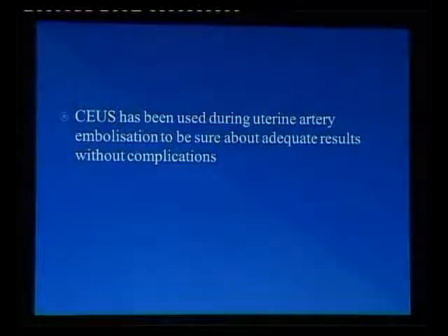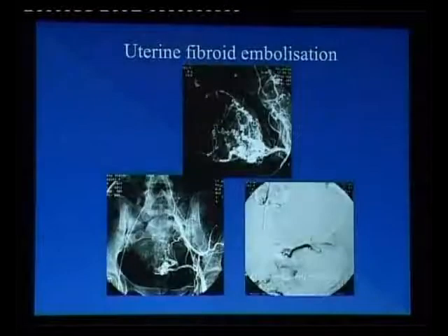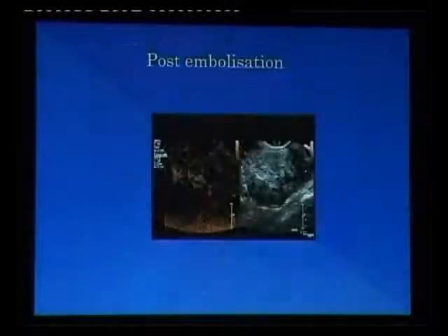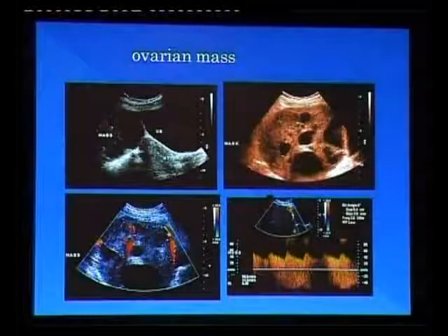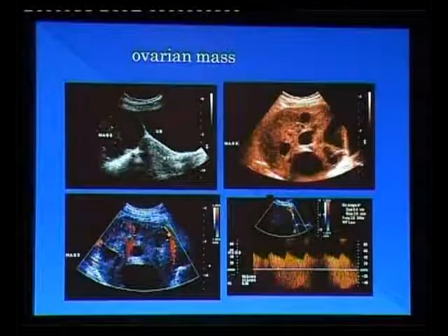Then of course we have been using contrast in fibroids after HIFU. In our center we were the first to start HIFU in the country. So we have been using contrast after HIFU to see whether there has been adequate devascularization or not, and of course after embolization. With this background, we now of course move on to ovarian masses.